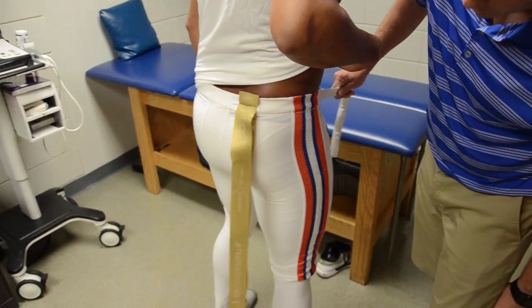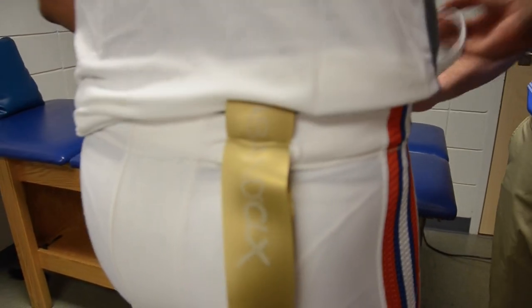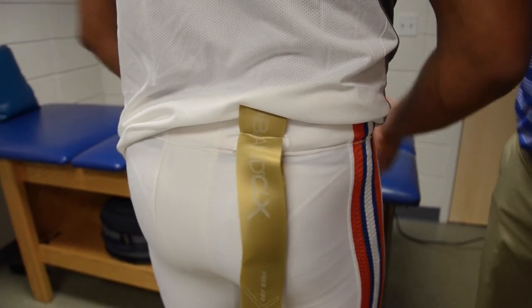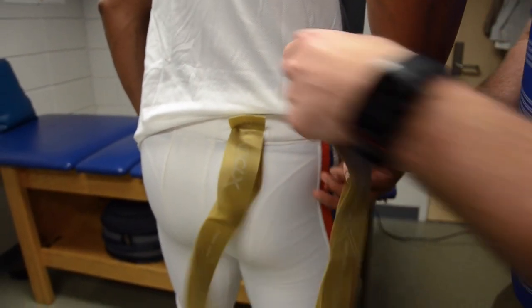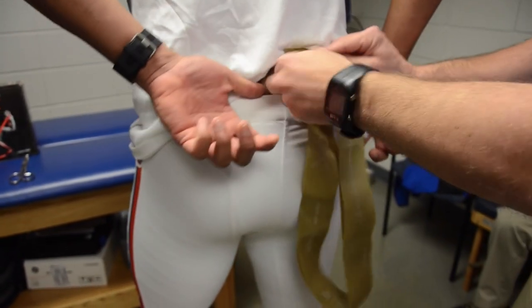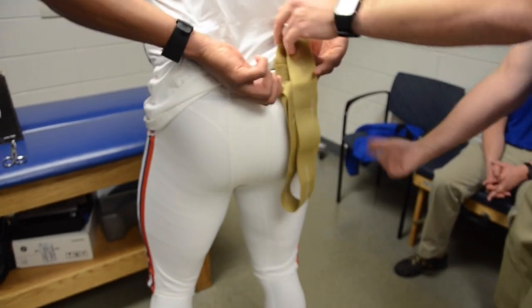And you can see how we have a loop now in the back. The athlete will go ahead and tighten up to a degree — you just want to kind of loop it, so we've got to slide it down before you tighten it. What we'll do now is give it to the athlete. We're going to have to slide it down underneath the pant and the tights. The tights are used to kind of just conceal the band. So you can get that and slide it down through there.